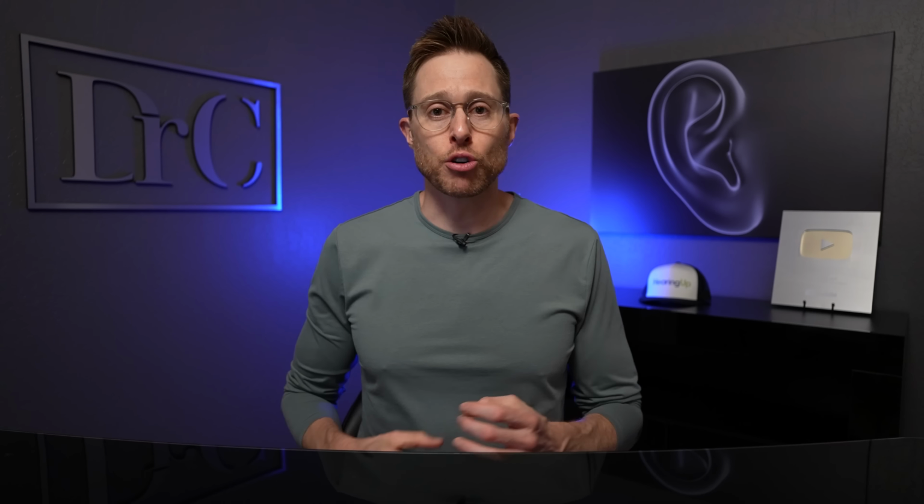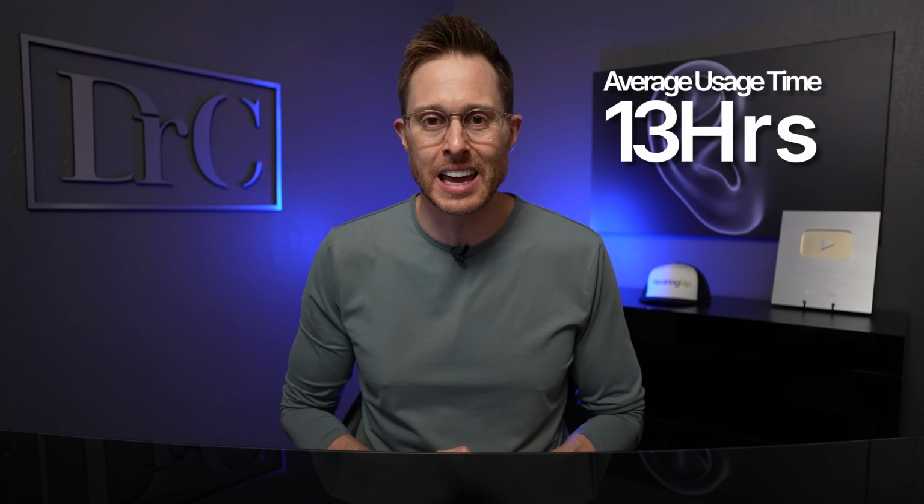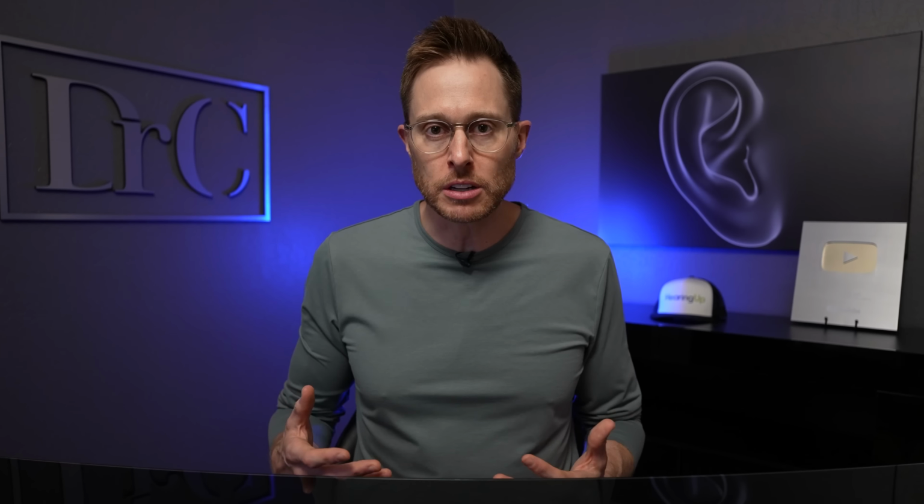Phonak does have some internal data that shows that the average Phonak hearing aid user uses their hearing aids for 13 hours a day. Of course, you are going to have some individuals who wear their hearing aids significantly less than that, and some individuals who wear their hearing aids significantly more than that. So if you're one of those individuals that wears your hearing aids for more than 16 hours a day, you'll probably have to sneak in a quick charge at some point during the day.